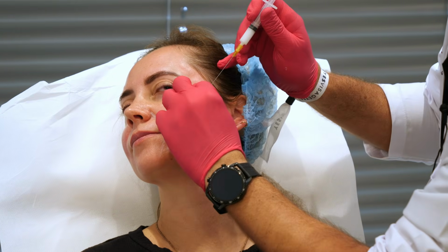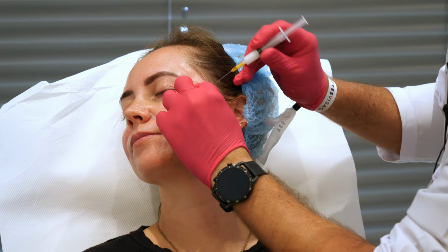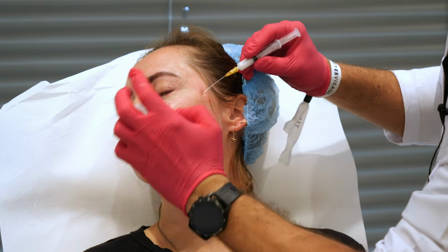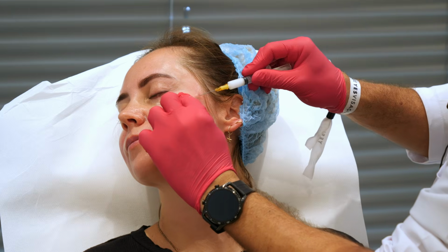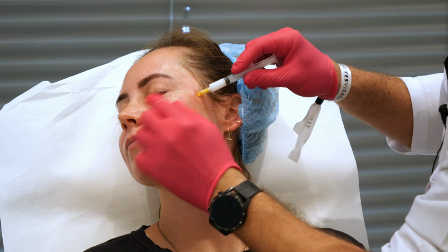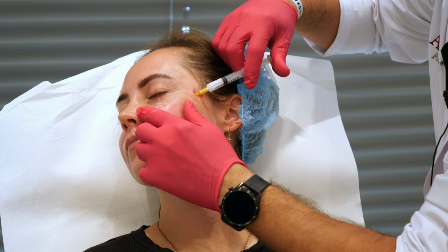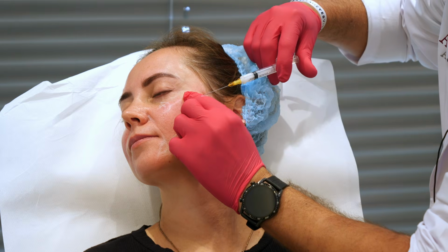From the same point, a lateral point, in the correct plane, go to the anterior malar zone and work another vector.